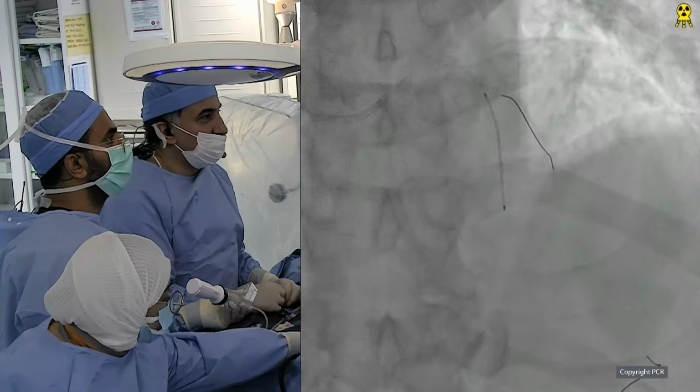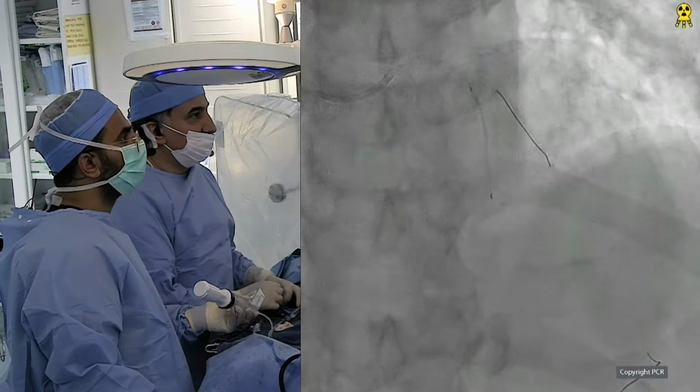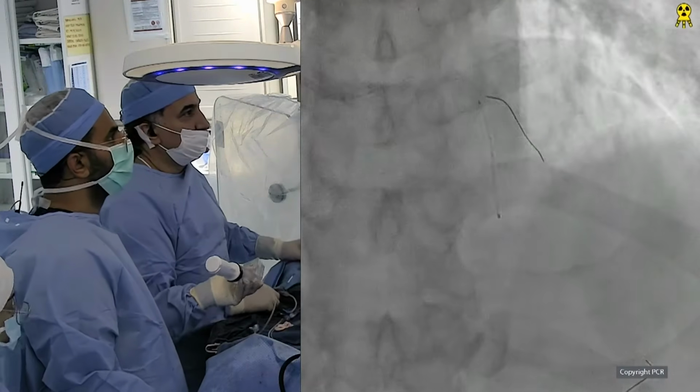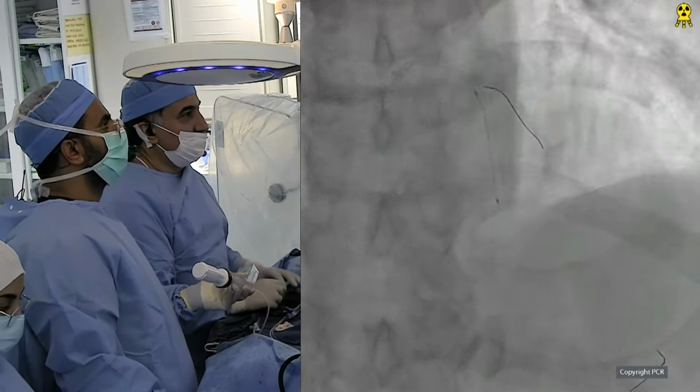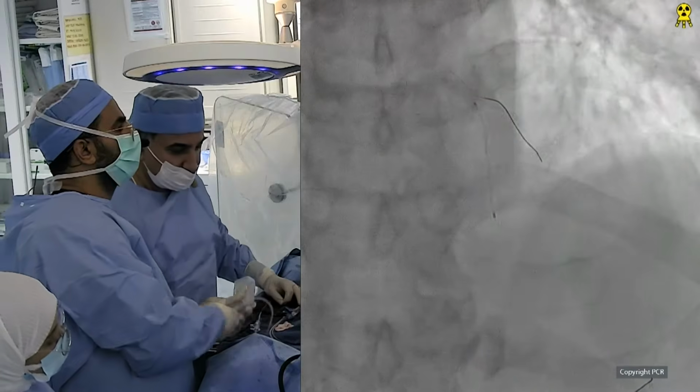What are your considerations for placement and avoiding overlap at the diagonal? Yeah, now we are distal already. We'll just go nominal. Go.